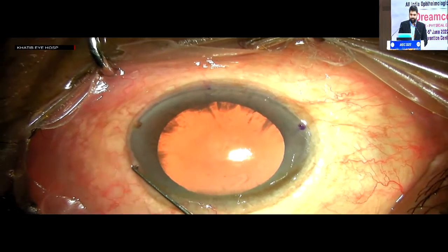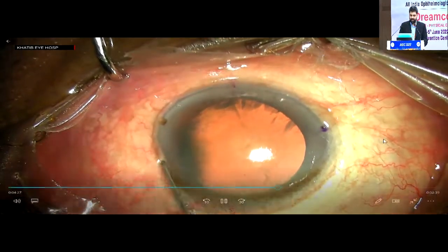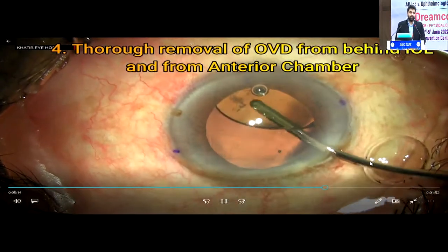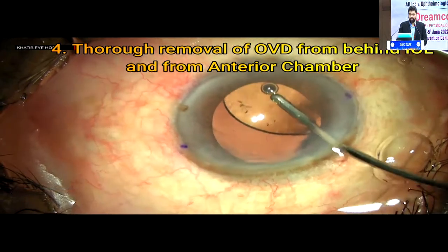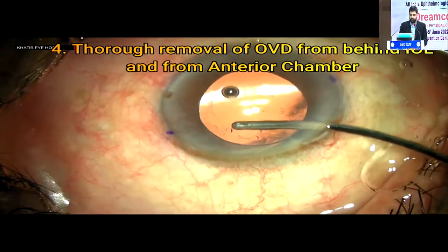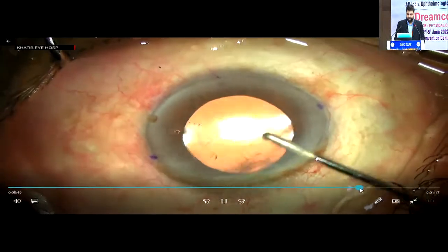This is pretty straightforward. Once you do this well, I've got my 20 degree marks, and you can just continue your phaco routinely. Once you've implanted your lens inside, one of the most critical steps is to remove visco very thoroughly from behind the lens, so that you get good rotational stability immediately post-op, and the visco doesn't make the lens rotate.